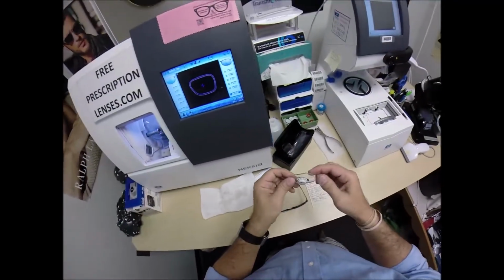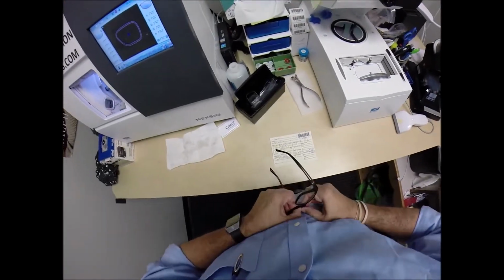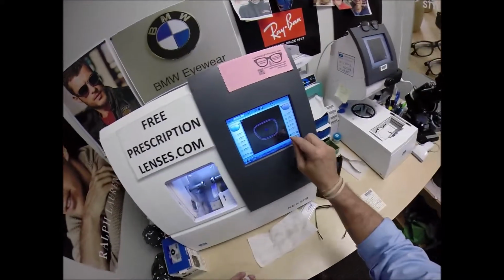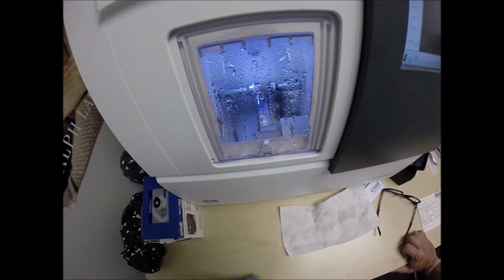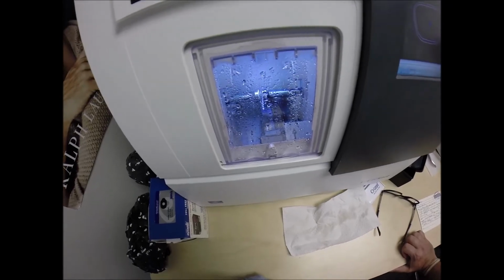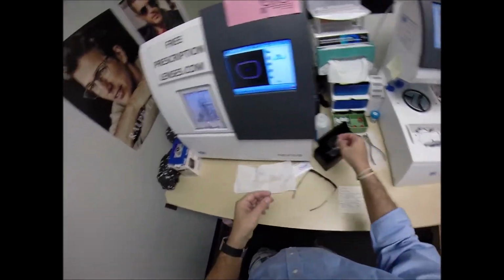And since I had to have these custom made, I went ahead and had these made as thin as possible. We're going to... Oh, it doesn't want to go, so let's take this down 1/10 of a millimeter. I don't know why, left lenses always need a little bit more than the right, even though you have the same power, practically in the same meridians. I'm going to put it in and take 1/10 of a millimeter off, going around the circumference of the lens until it snaps in there easily.